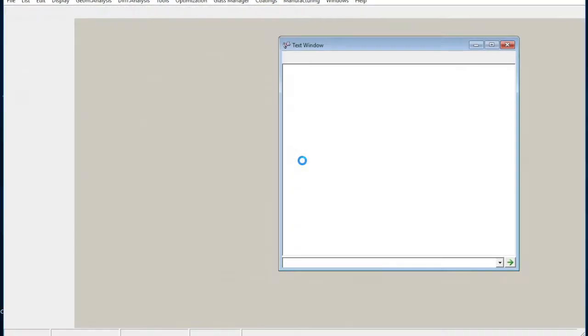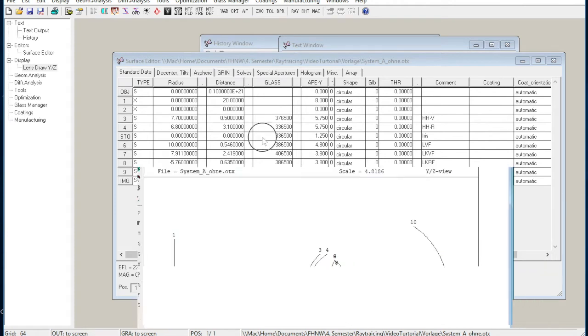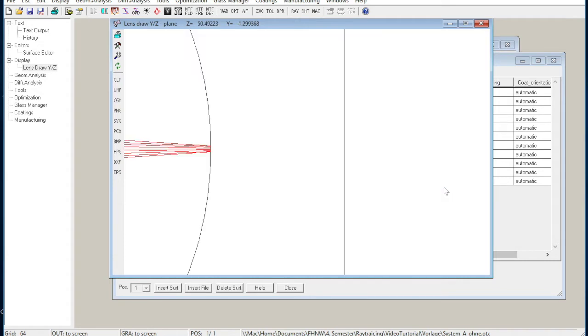We allowed ourselves to prepare an eye in advance. It is based on the Gullstrand eye model. If you want to have the data, just press the pause button now. And that's what it looks like. We made the eye, for our example, approximately 5 dioptries hyperopic. You can see it here on the retina.